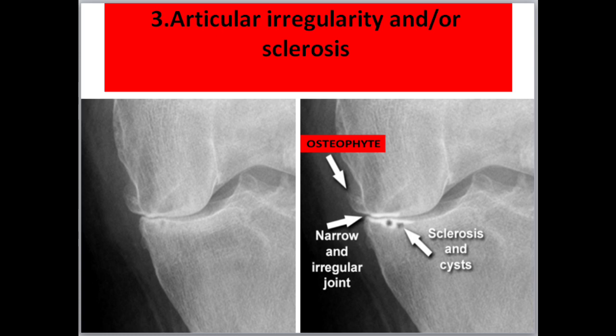Three: articular irregularity and/or sclerosis. This picture shows the joint space is narrowed and the cortical surface is irregular. Increased density of the articular surface indicates sclerosis, and small subcortical cysts have also formed.